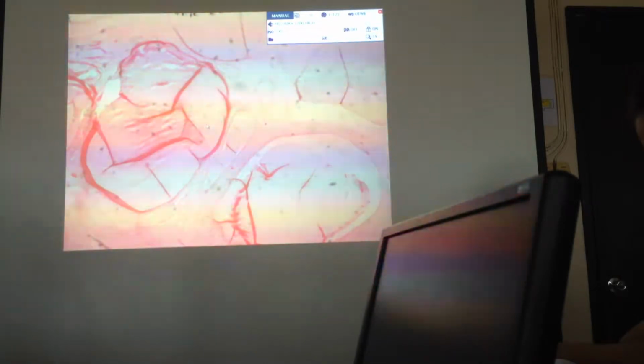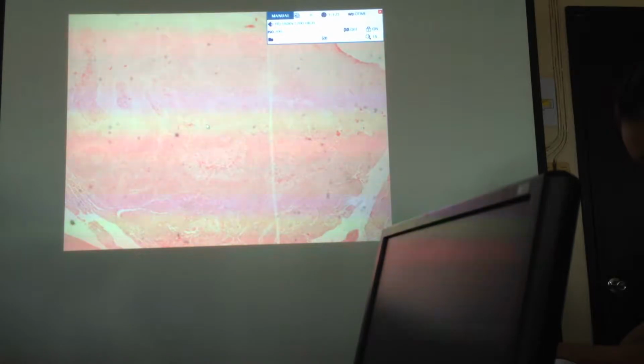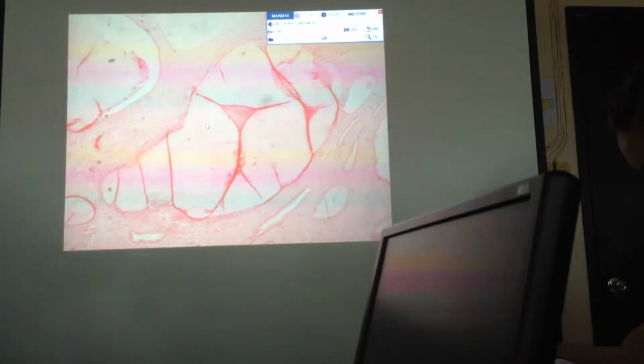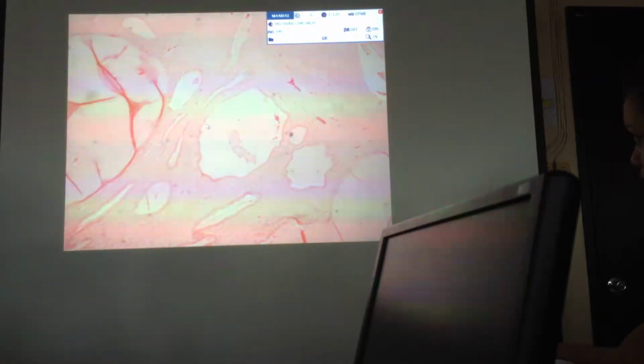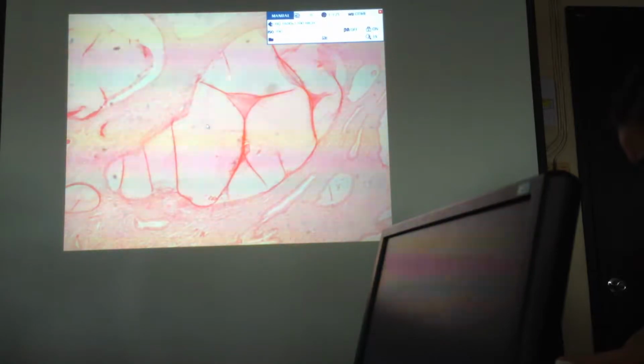Invasive squamous cells. So here are some of the portions of the slide for slide 17. You can see large dilated cervical glands. Okay. I think this was tackled in the first part of the cervical discussion.